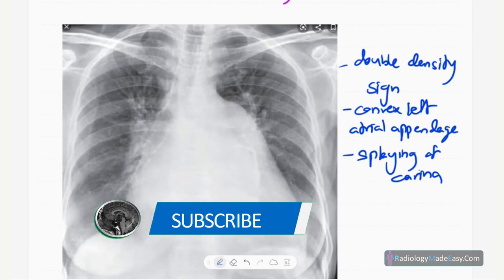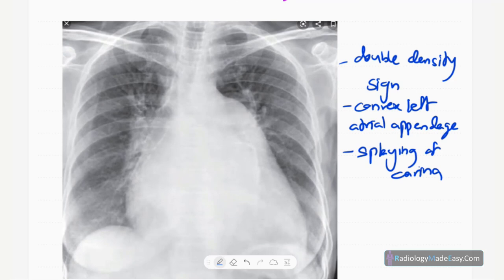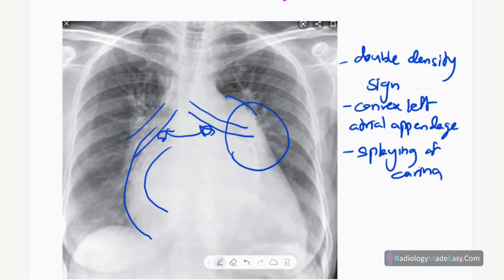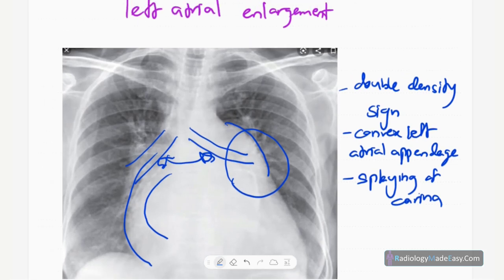Next we discuss left atrial enlargement. Features include cardiomegaly, a double density along the right heart border due to the enlarged left atrium, splaying or widening of the carina, and a prominent left atrial appendage with convexity along the left heart border.